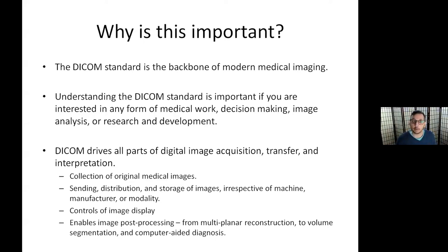So the DICOM standard is the backbone of modern medical imaging. Understanding it is important if you're interested in any form of medical work, decision-making, image analysis, research, development. If you want to be a nurse or a physician, or hopefully a physicist, DICOM is going to come into play. It drives all parts of digital image acquisition, transfer and interpretation: the collection of images, the storage of images, and the control of the display. In diagnostic radiology, because they're looking at subtle differences, it's very important that the displays are reproducible and always emitting the same light intensity. That is embedded in the DICOM image.